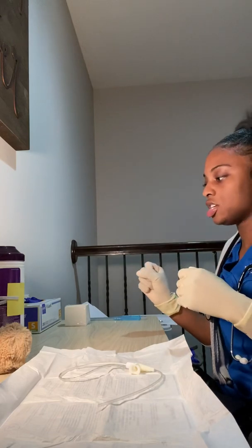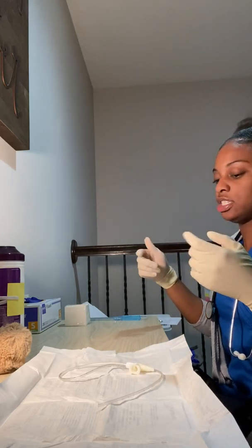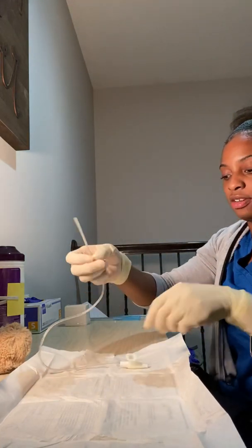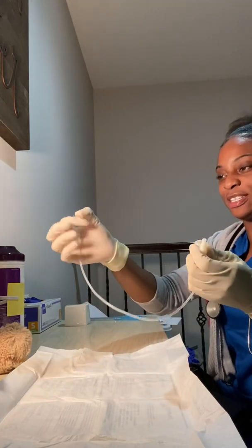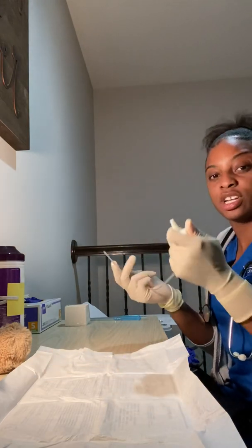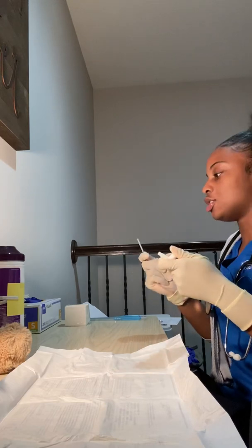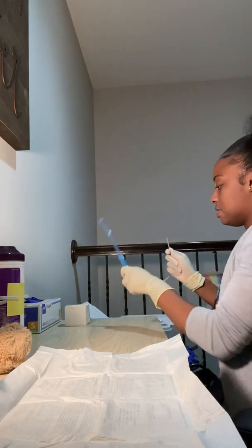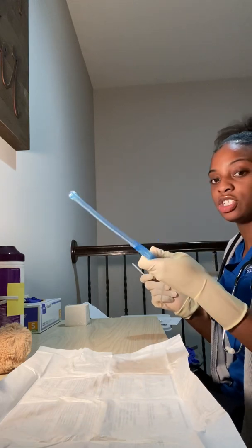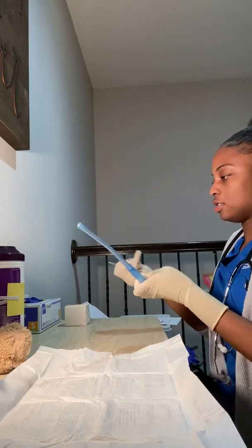I've hyperoxygenated my patient. I've removed my trach collar, hyperoxygenated my patient for about a minute, just to allow her to have more oxygen than needed, since she's gonna be off of her oxygen. Okay, so in my right hand is where the catheter is, so I'm gonna wrap that into my hand. And this part is going to be connected to suction. I'm gonna be connecting this to suction, so I know that my left hand will not be sterile any longer. So once this is in my hand, I can go ahead and connect this to suction. I'm connected to the suction. I'm going to check my suctioning. And it's working good.